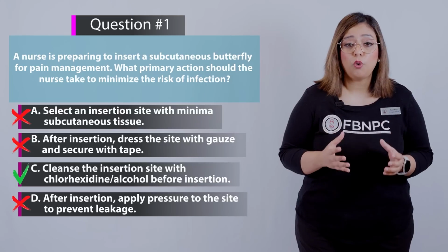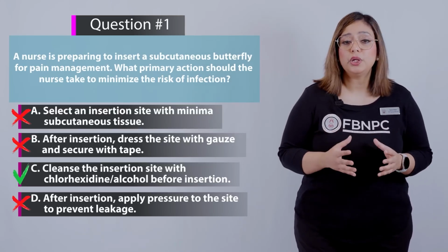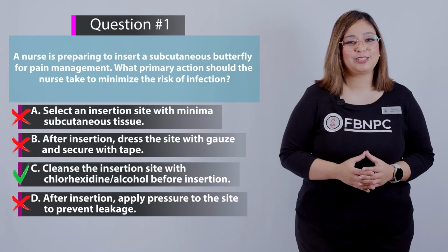The primary focus and the priority is to minimize the risk of infection during the insertion and securing of this device.